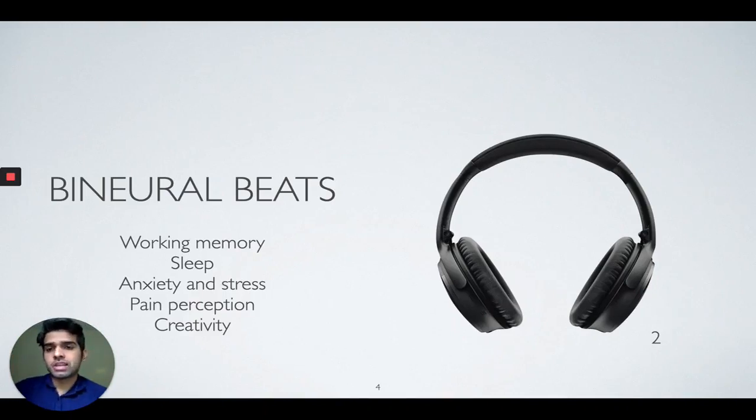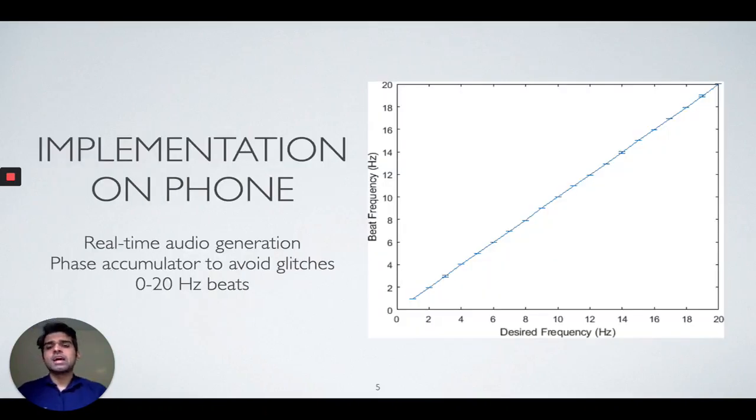And this has been used in applications like improving working memory, inducing sleep quicker, reducing stress, pain perception, and improving creativity and divergent thinking. So what we wanted to do was implement this on a phone.